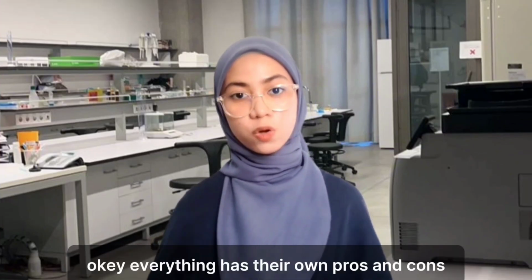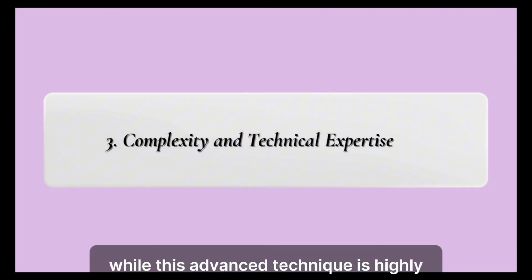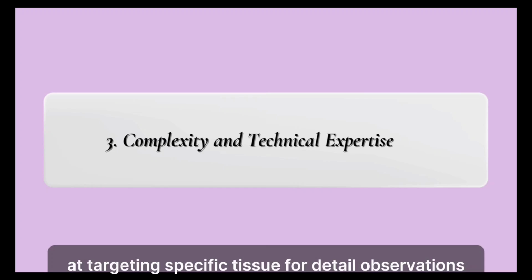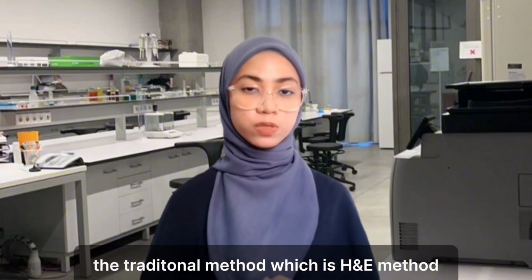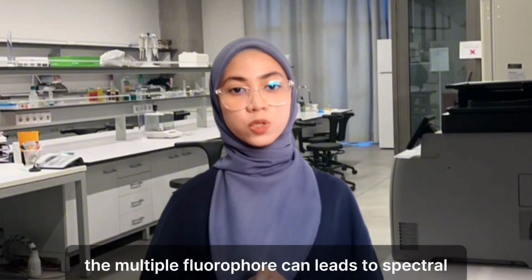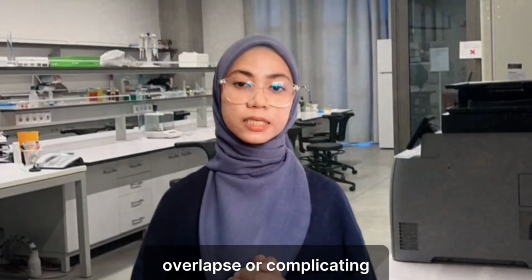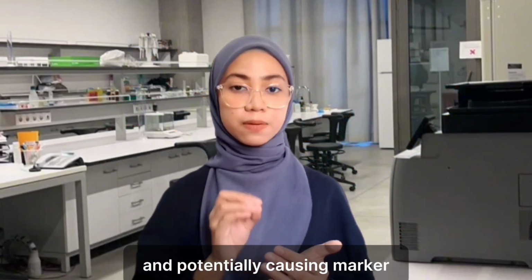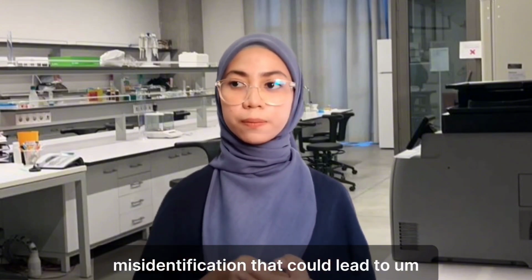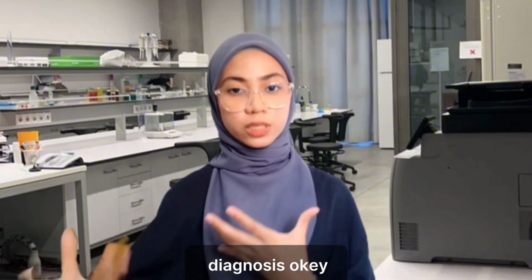Okay, everything has its own pros and cons, and MIF is no exception. While this advanced technique is highly efficient at targeting specific tissue for detailed observations, it involves a more complex procedure compared to the traditional methods. Using multiple fluorophores can lead to spectral overlap, complicating the interpretation and potentially causing marker misidentification that could lead to misdiagnosis of patients.